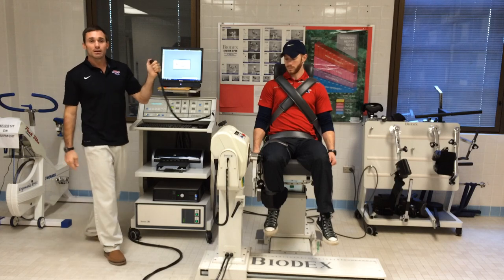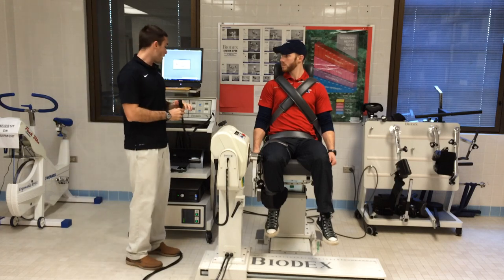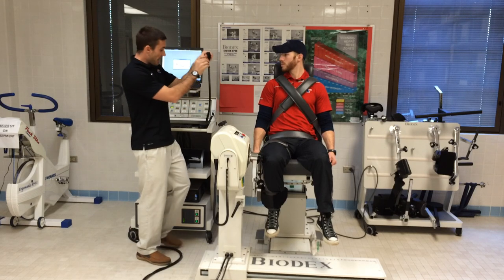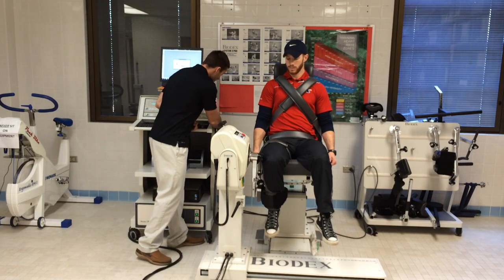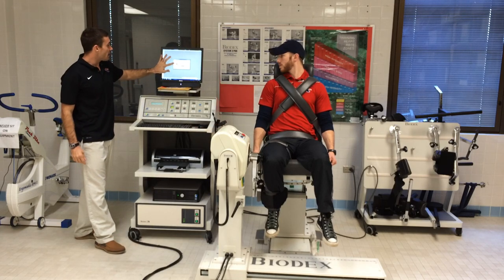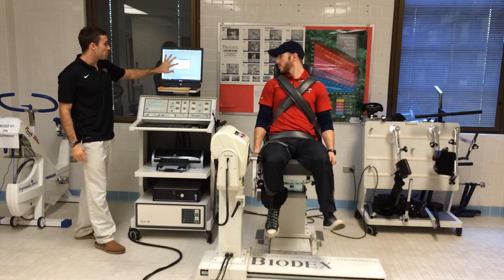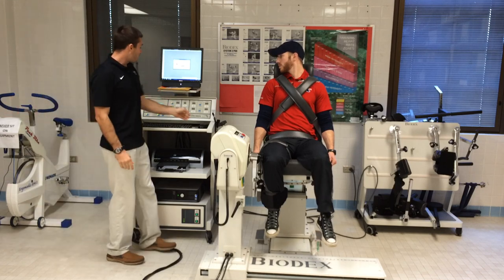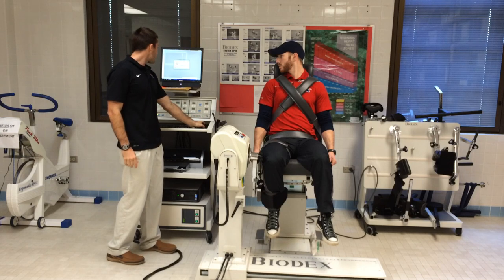And I lock him in. Again, he can relax, it's not going to go anywhere. Now we're going to hit his toward limit, we're going to hit set. At this point, we can put this back for now, right on the Velcro strap. You'll see on the screen, we have this red A and T with the red block in between. That's going to show we properly set the limits. From here, we hit continue.